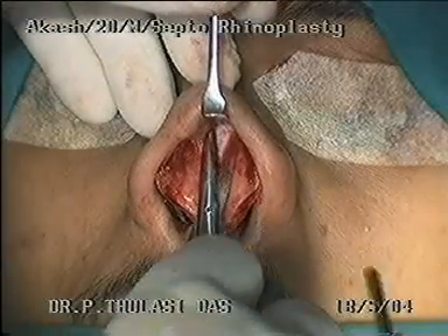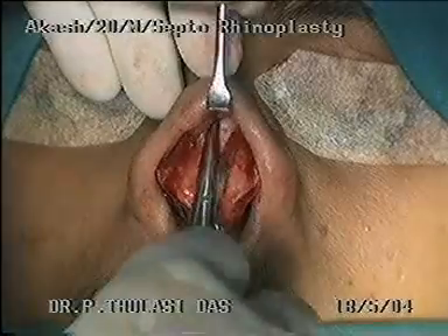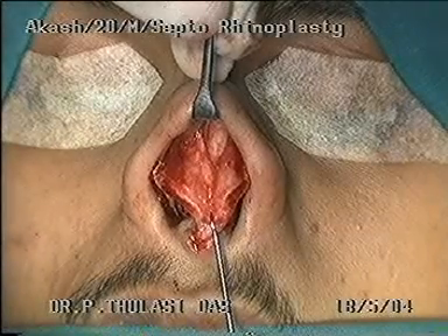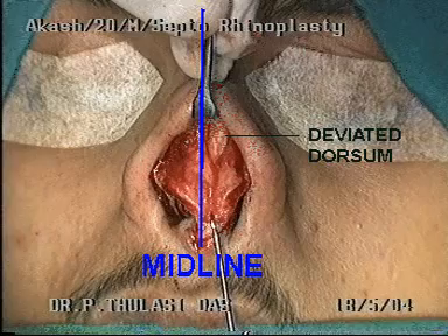One finger on the dorsal surface of the skin guides the dissection and prevents buttonhole. Once the dorsum is reached, dissection proceeds very close to the cartilage surface. The deviated cartilaginous part of the nose can be appreciated now — this shows the amount of deviation of the nose away from the midline.